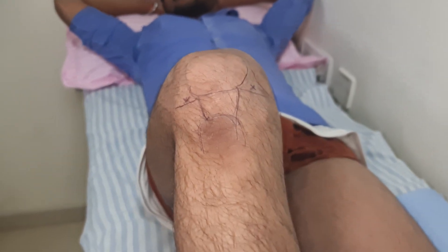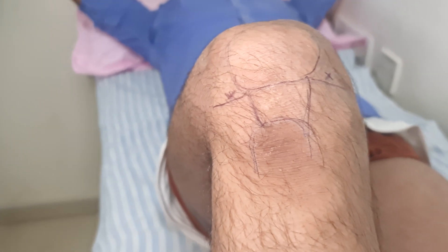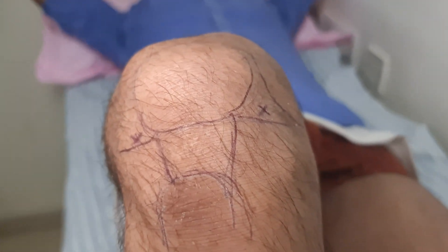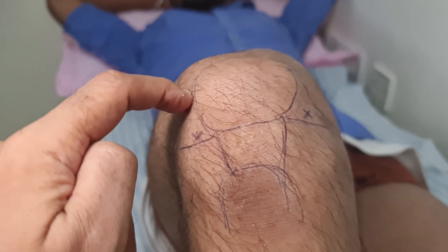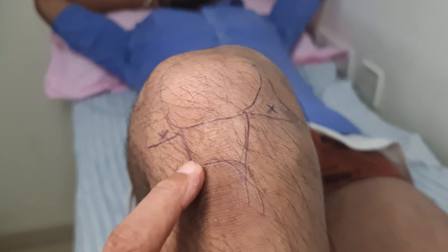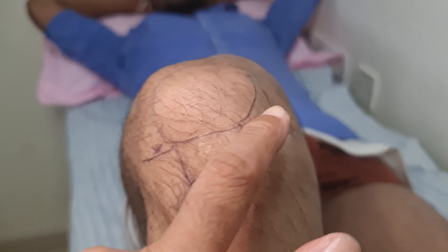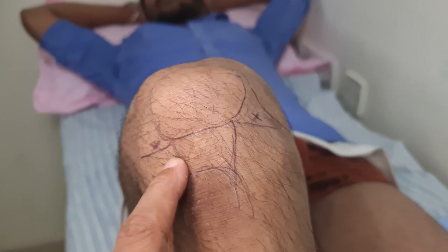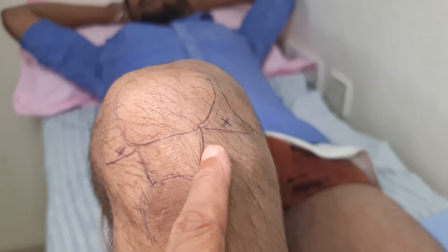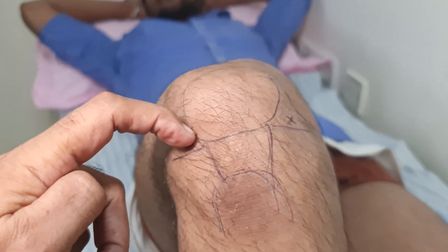The patient is lying on the table and this is his knee. I have marked out the anatomy of the knee: this is the outline of the patella, this is the tibial tuberosity, this is the joint line — this horizontal line — and this is the confine or the limit of the patellar tendon.